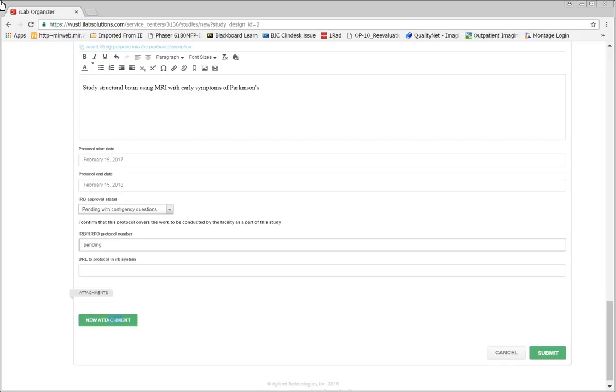Here you can attach any additional documents related to the project, including a hard copy of the protocol, the consent form, or any approval documents.